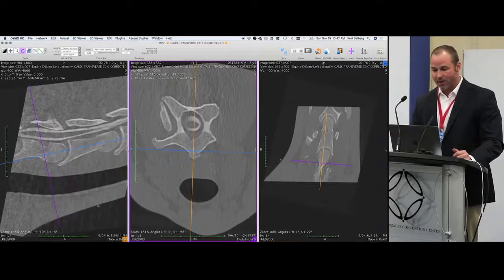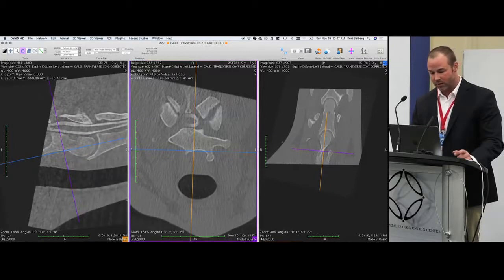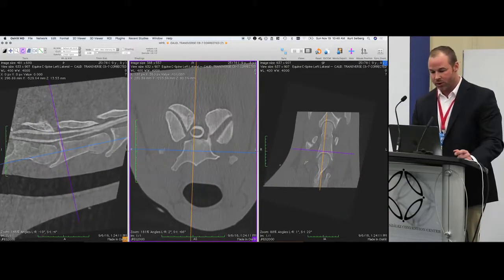And the myelograms have been instrumental. We can also see morphologic changes very, very nicely within the dorsal articulations, so the articular processes, as we move more caudally. And as we see in this one, we have a very nice area of bony stenosis as we move through, larger articular facets, and we can see the lateralizing narrowing sitting right here as we move down.